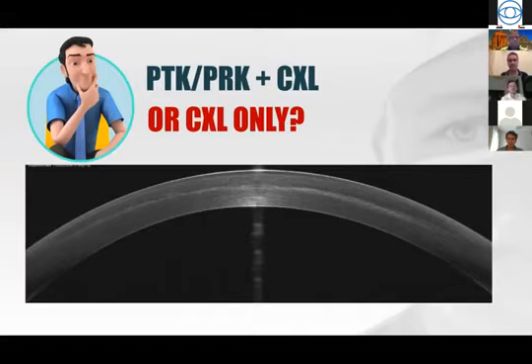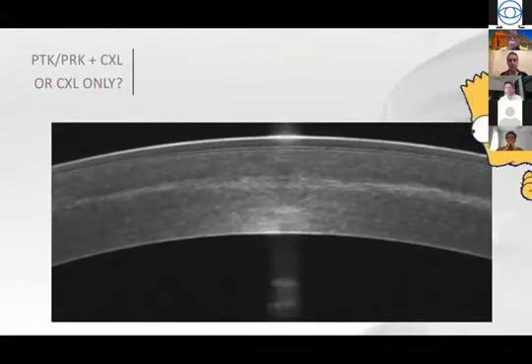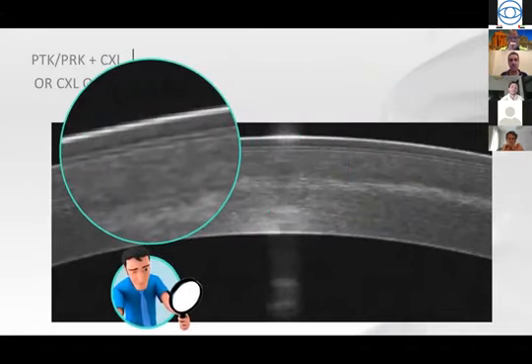And I was like, did the patient have PTK with cross-linking, or a topography guided PRK or corneal wavefront guided PRK with cross-linking? That's important to find out. He has a good demarcation line, as you can tell here. But how can you find out? Again, by tomography using OCT, you can. If you can take a quick look, there is one sign that is so pathognomonic, and you can tell that that patient didn't have any kind of PRK or PTK. Now, that sign would be the Bowman's layer, as you see here, the bilaminar layer of Bowman's membrane. And you can look and scan through, it's there. So that's the importance, again, of OCT here, not just looking at the anterior float or posterior float.